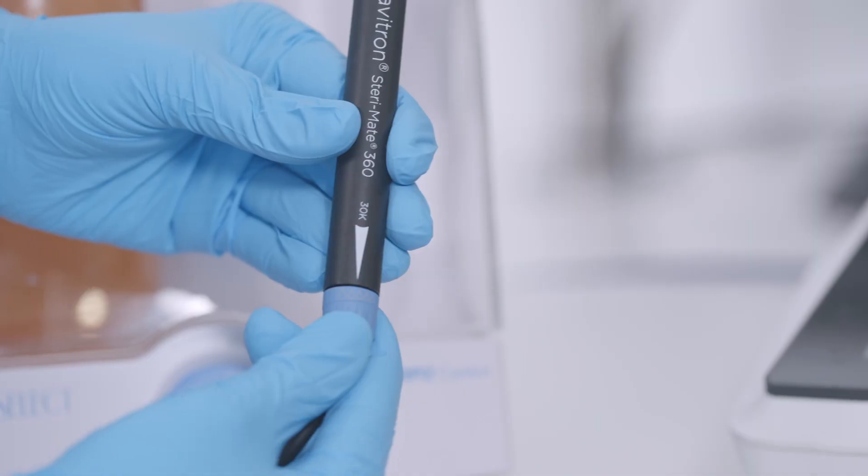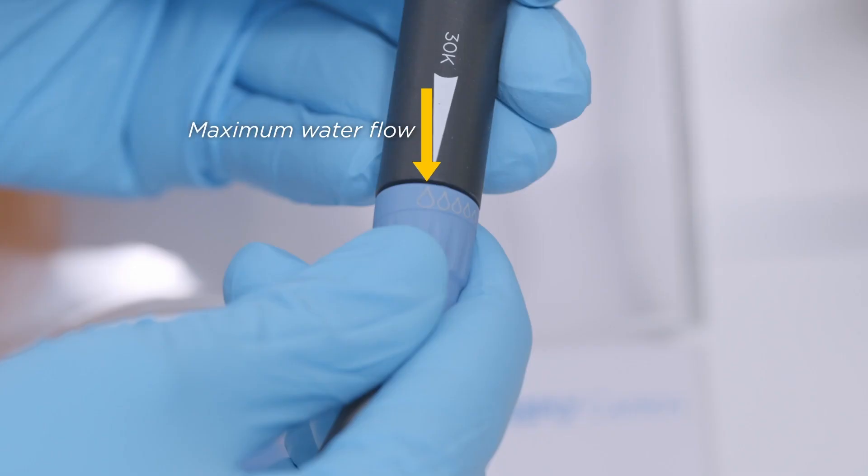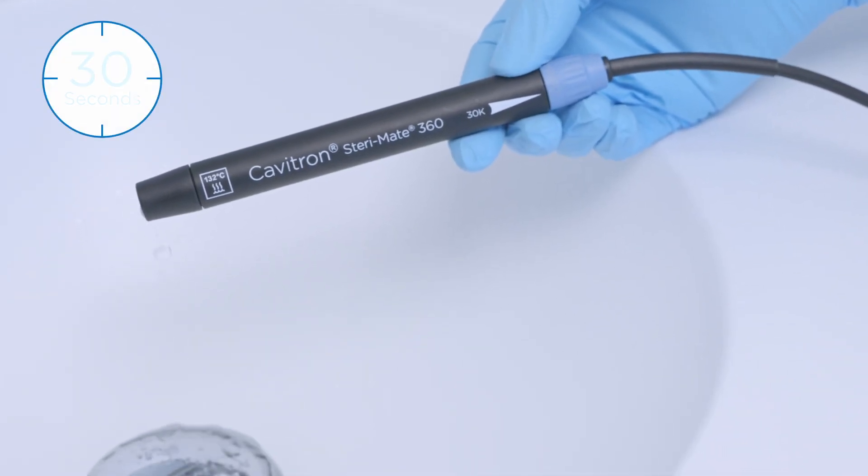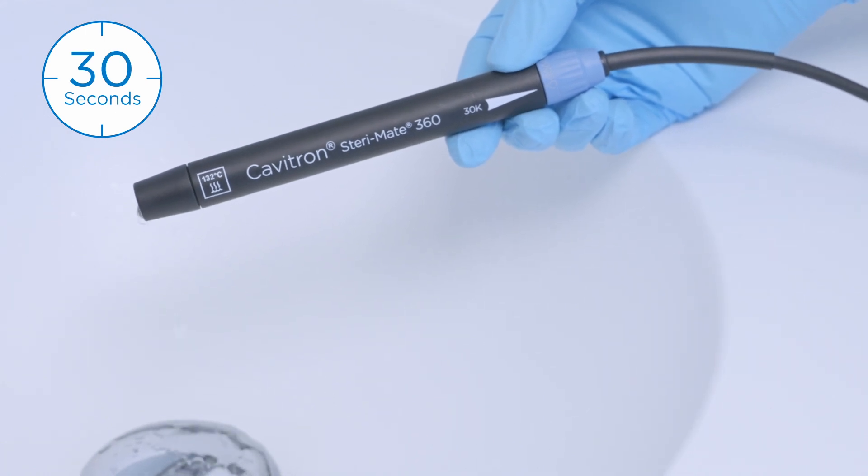Adjust the lavage water control at the base of the handpiece to maximum water flow and begin to flush the 1 to 10 sodium hypochlorite solution through the system for at least 30 seconds. Ensure that the solution is exiting the handpiece.